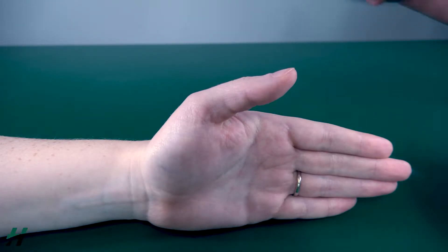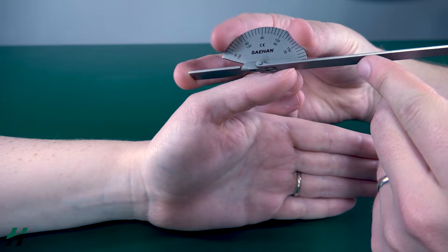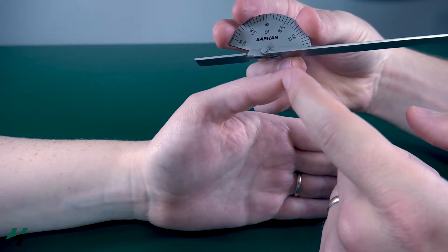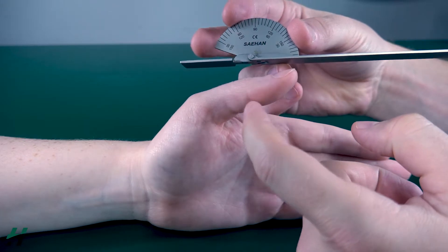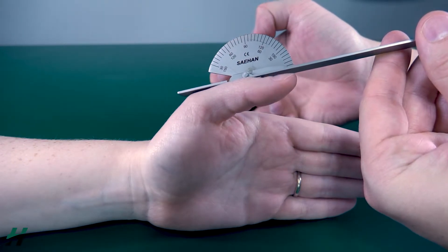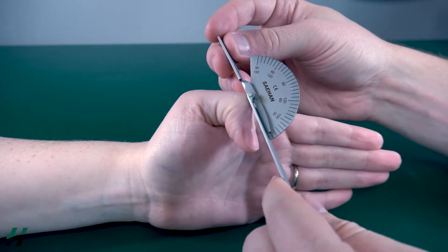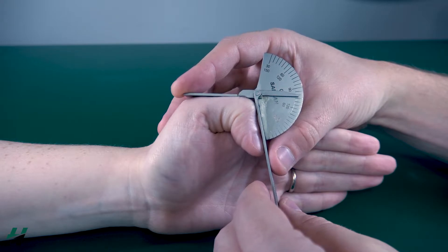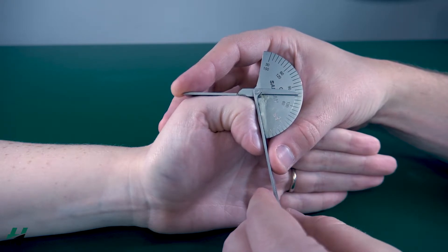Measuring thumb IP flexion. Have your stationary arm on the proximal phalanx, your movement arm on the distal phalanx, with your axis on the IP joint itself. Rachel, flex your thumb down as much as you can. We are looking at 75 degrees of flexion at this joint.